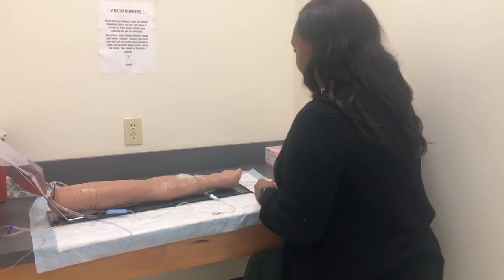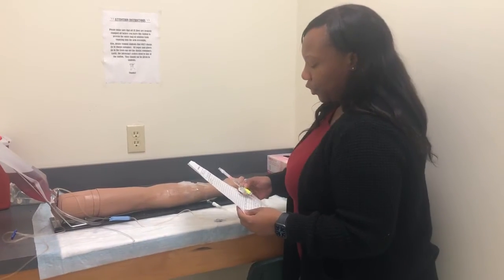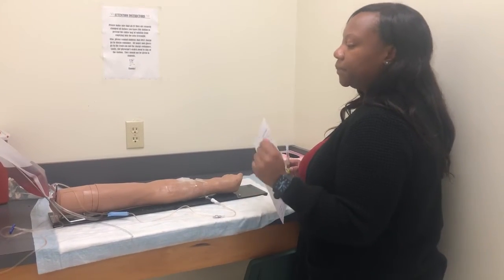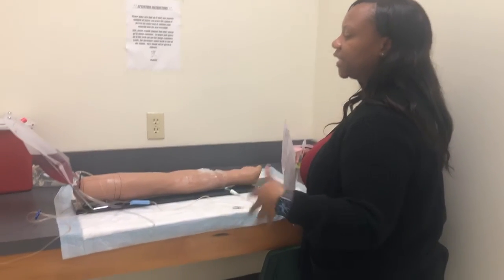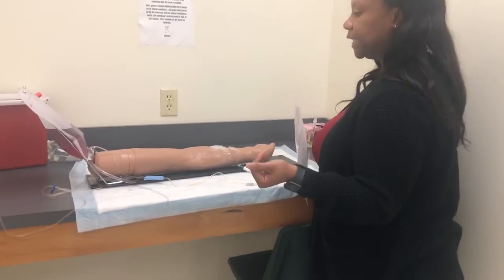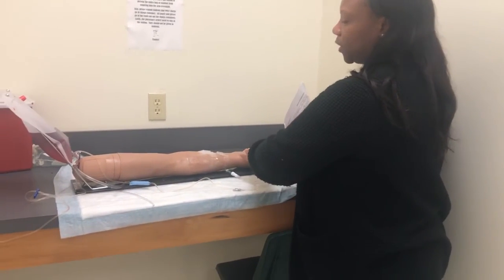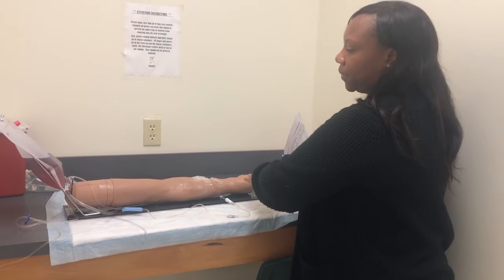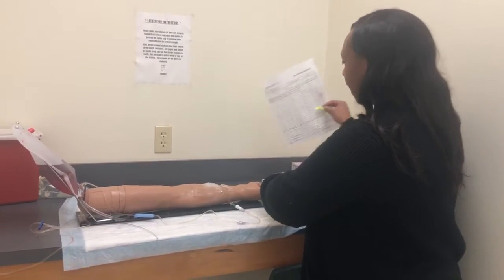Okay, Miss Green, so you're getting furosemide 30 milligrams by IV push. Dr. Moore ordered it to get some of your edema off. One thing is it will probably have you going to the restroom because it takes the fluid off you. So if you need any assistance, just let me know, or any staff, so we can assist you. Make sure your call bell is in reach, so when you need assistance, you can just use your call bell.